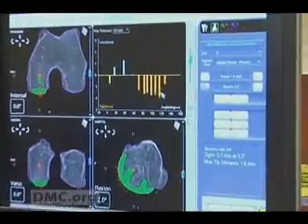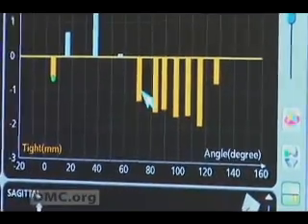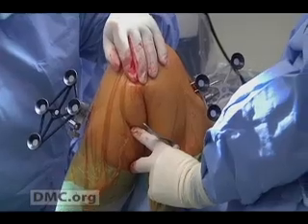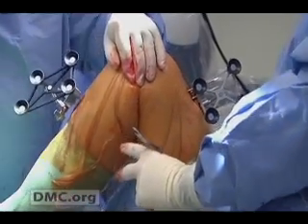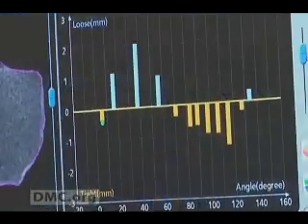See those orange bars below the line? That's a little bit too tight, and we can see that she probably wouldn't move her knee well if we left it like this. So what we can do now is move the prosthesis that we're going to put in this knee to adjust that and loosen it up a little bit.